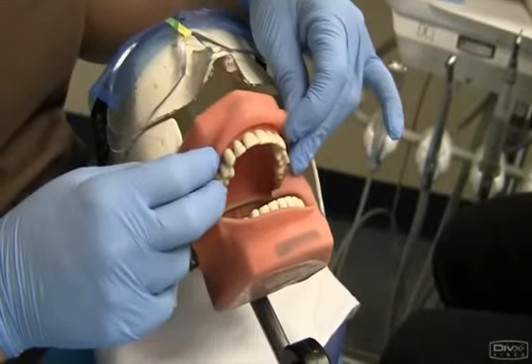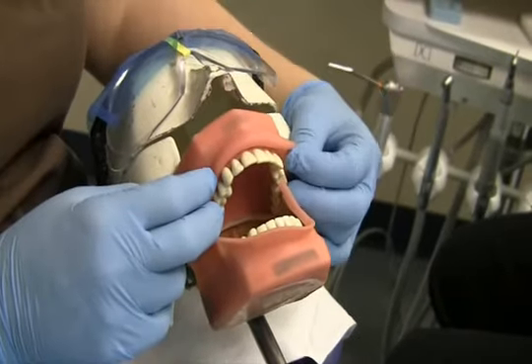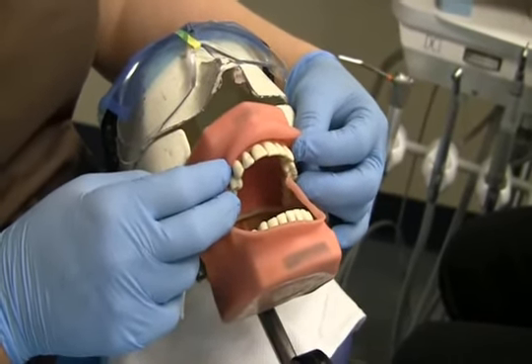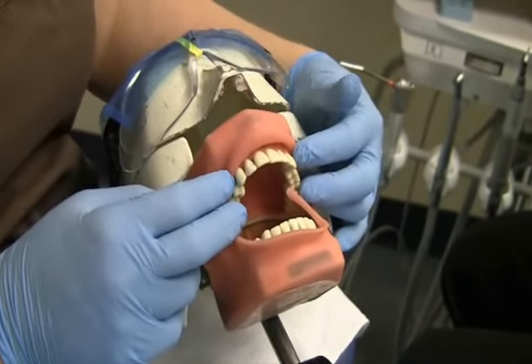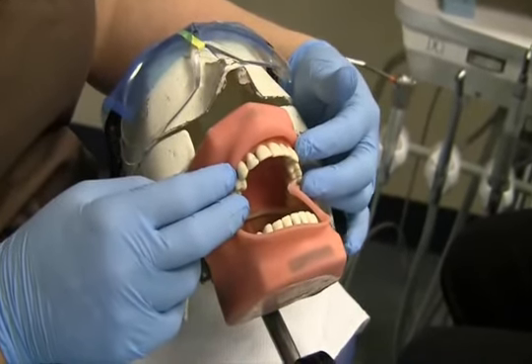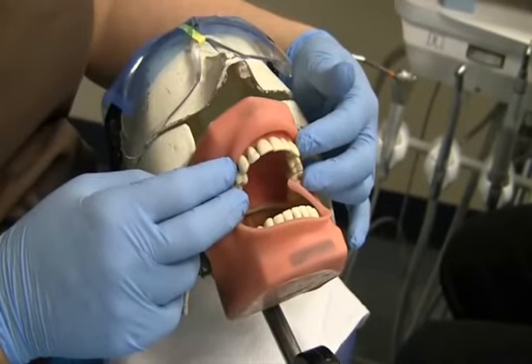The procedure we're going to demonstrate is oral surgery. The first one we're going to do is a simple extraction. We're going to assume that our dental assistant has applied the topical anesthetic. The tooth we're removing is the 1-1.